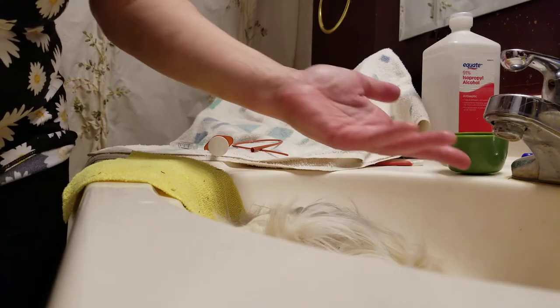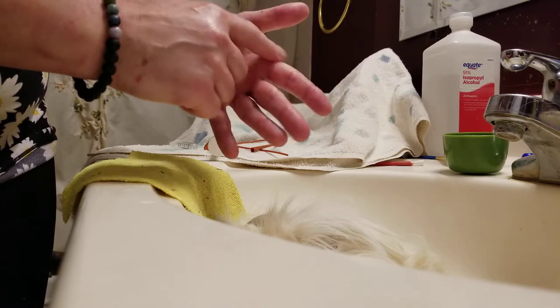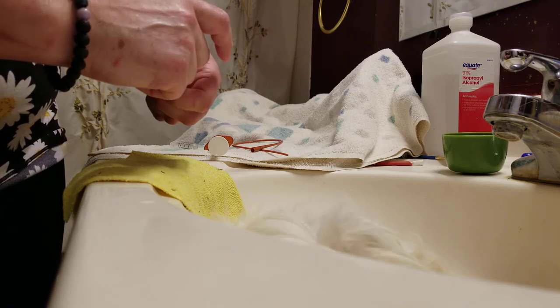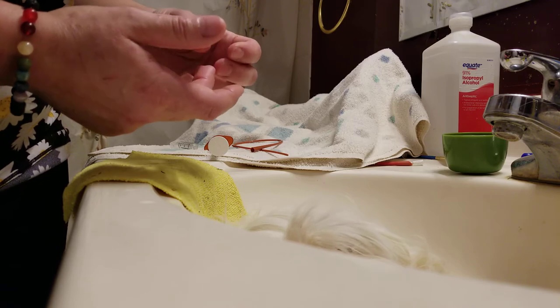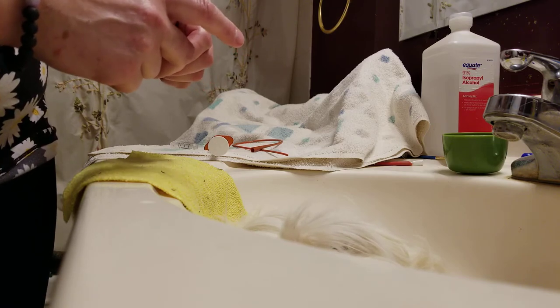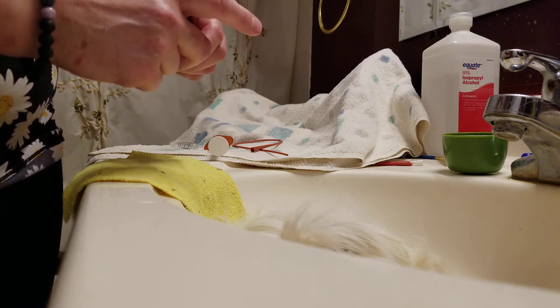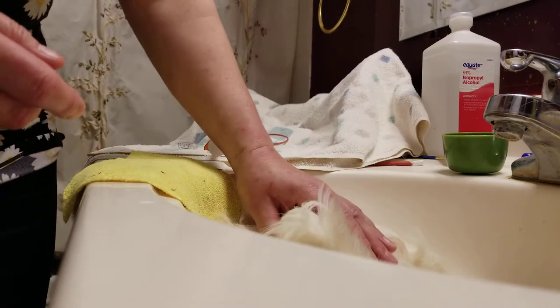This guy here — I'm not really sure what's wrong with him. He had evidently stopped eating, so it started off with stasis. However, he doesn't appear to have any sensation to his rear end, and he does have some neurological issues, so I suspect he may have had a stroke. At this point I've just been tube feeding him to keep his digestive tract moving. Something I'd like to mention: with the critical care, I will get fresh poop from a healthy guinea pig and mush it in with the critical care. You have to make sure it's really well mushed in, otherwise it won't fit through the catheter. Make the critical care just a little bit soupier than you normally would per recommendation.